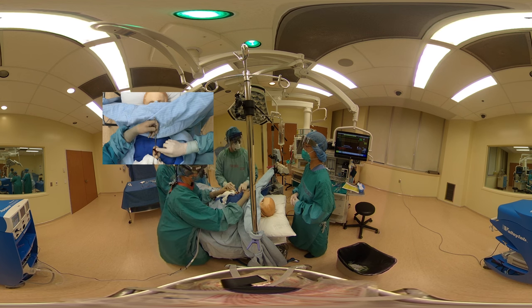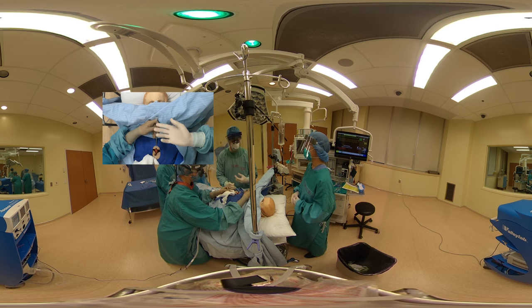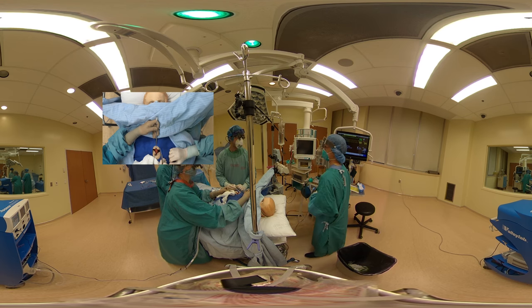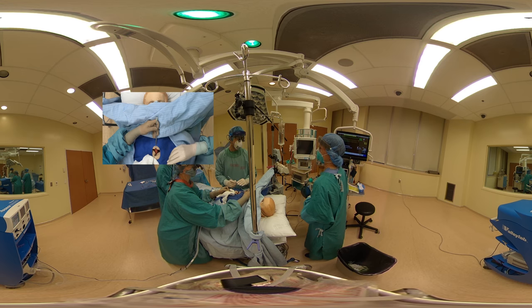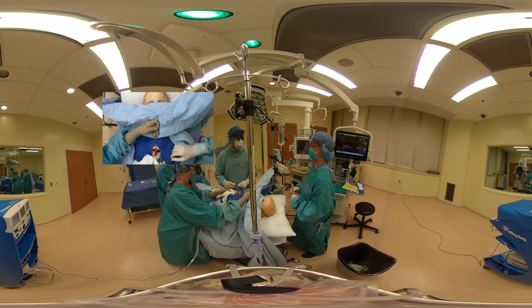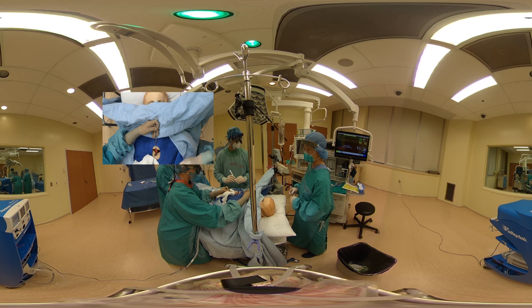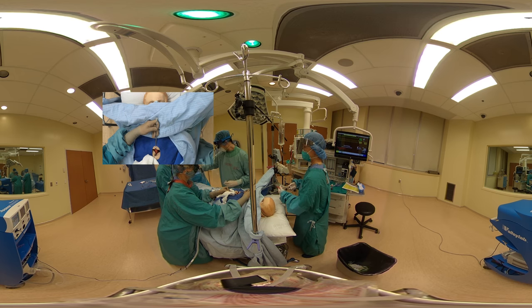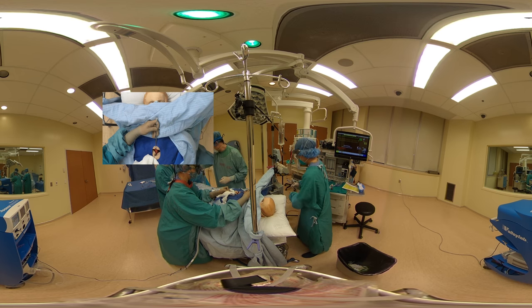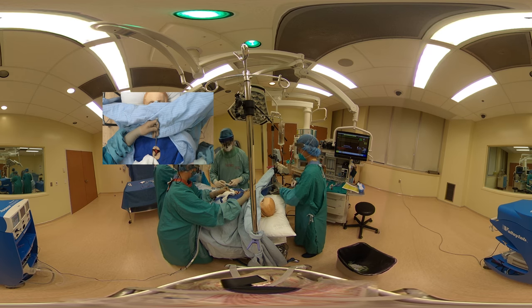So to minimize coughing from the tracheostomy site and contamination from the wound, I think in this particular case we could induce general anesthesia with paralysis now, and then proceed with the tracheotomy very rapidly once we stop. So are we all ready to go with that? Good. We have our backup measures if the insertion is difficult.